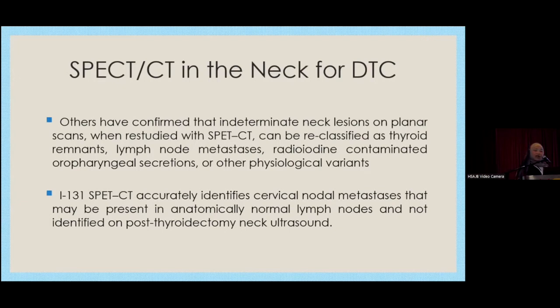And there is a value of SPECT-CT even though we sent the patient for ultrasound, which said it is a normal lymph node, but with iodine SPECT-CT, it showed that it is actually disease. So there is a role of SPECT-CT in cases where even though ultrasound mentioned there are lymph nodes, we should consider doing SPECT-CT.